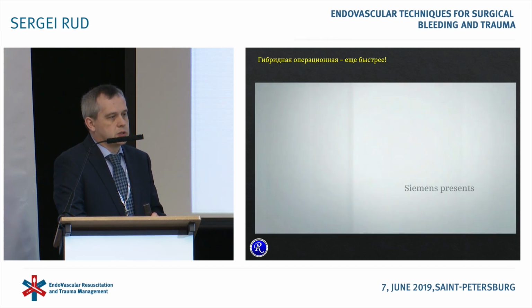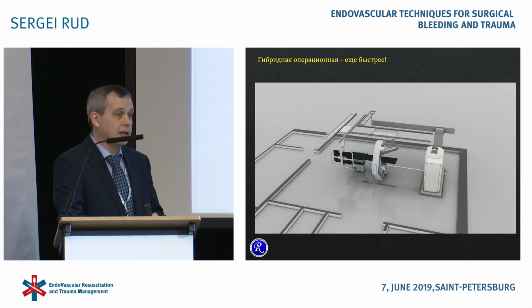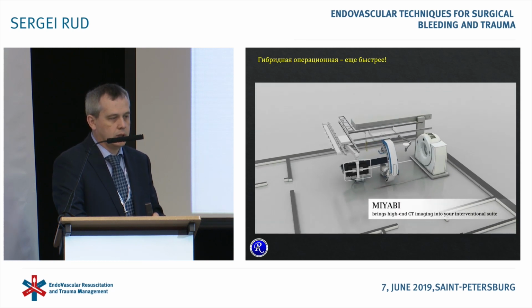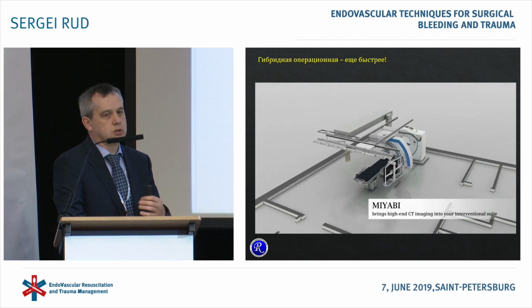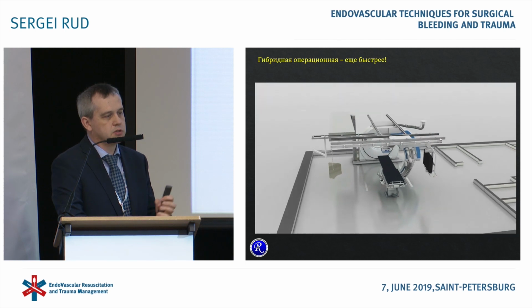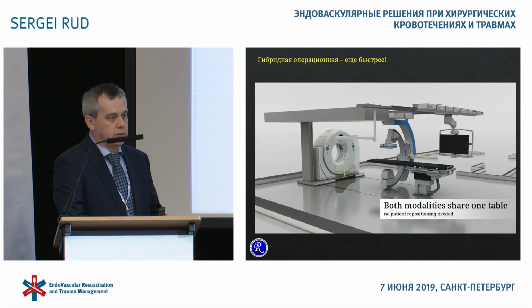The best option, if there is such an opportunity, is to have a hybrid operational room with the angio CT at the point of medical care provision, because it speeds up medical care. Such systems have been developed already, and in St. Petersburg we have 2 hybrid operational rooms.